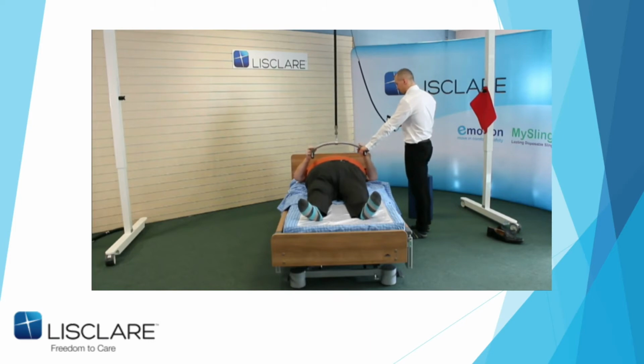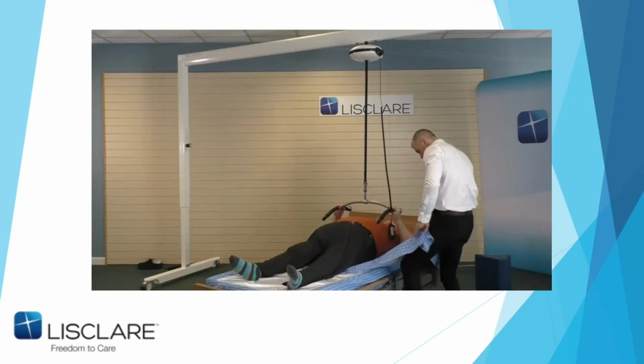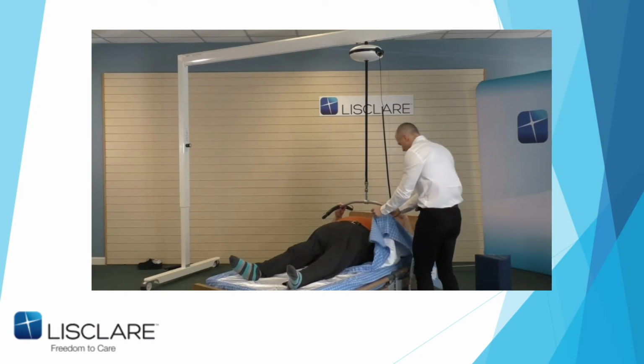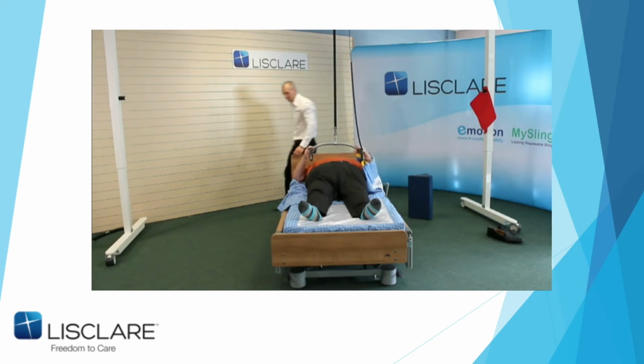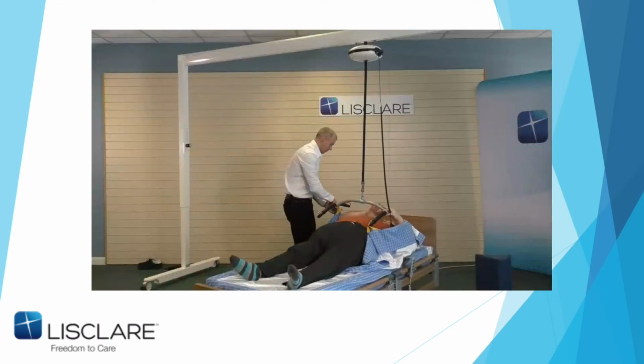I'm being very good, but I'd be a passive patient, so I wouldn't be doing this for John. Just spoiling them today. And all I used to do for this manoeuvre is hips and shoulders, because he's not moving me up the bed. Okay. Thank you, John. Because all he wants to do is he's going to turn me on my right-hand side, so he needs to move me to the left side of the bed.